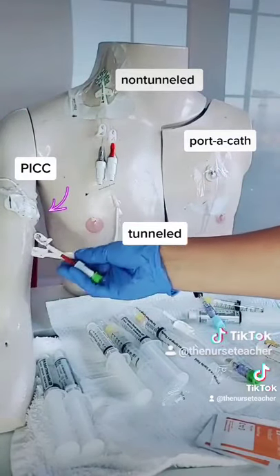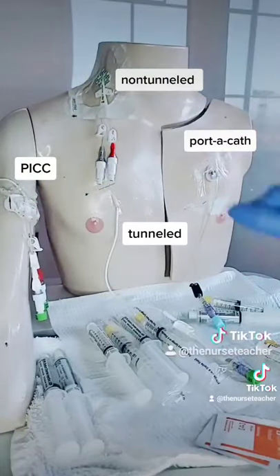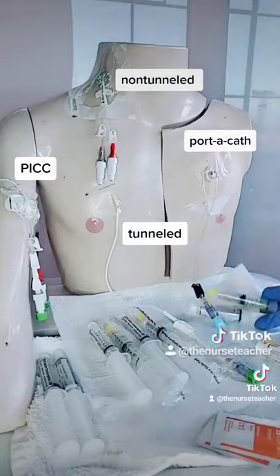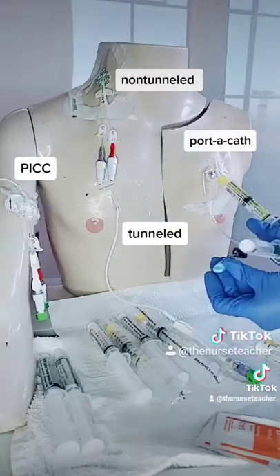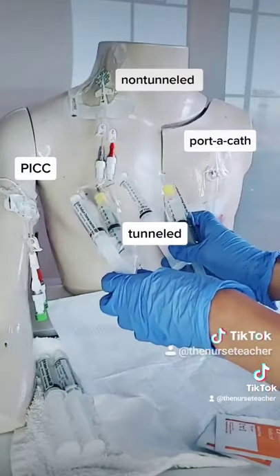And lastly, our PICC — our peripherally inserted central catheter. It starts off in a peripheral vein and is threaded into a central vein. All of these have different flushing and locking requirements depending on the manufacturer and the length and gauge of the line.